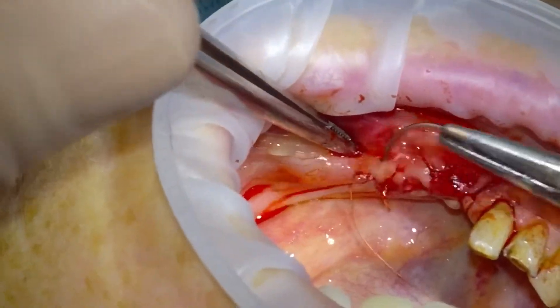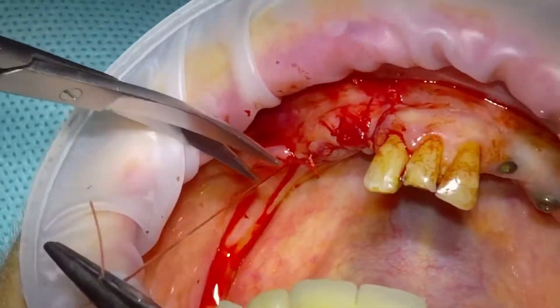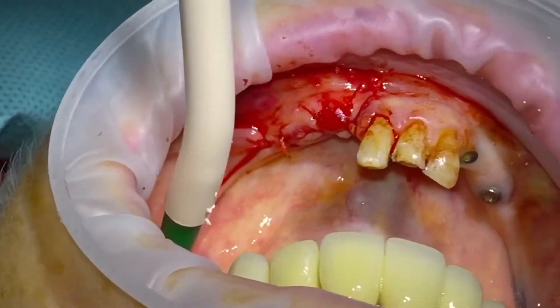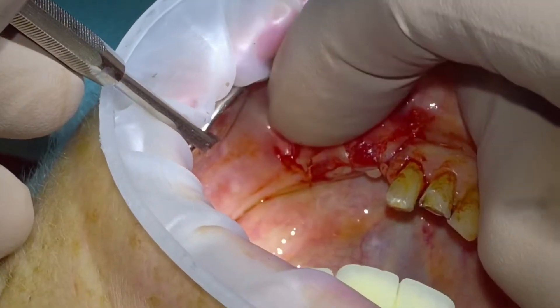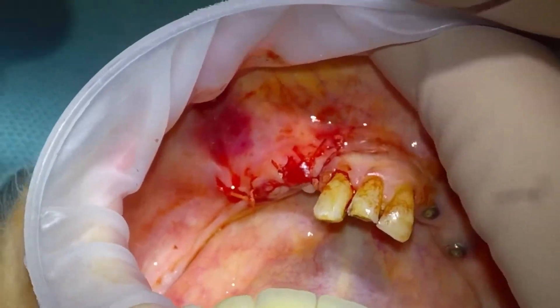And then the small distal relieving incision — there we go. We've now got a nice significant ridge rebuild, ready for future implant placement.